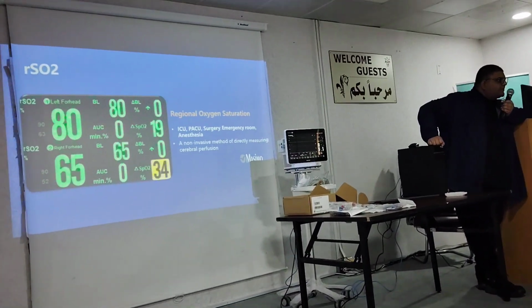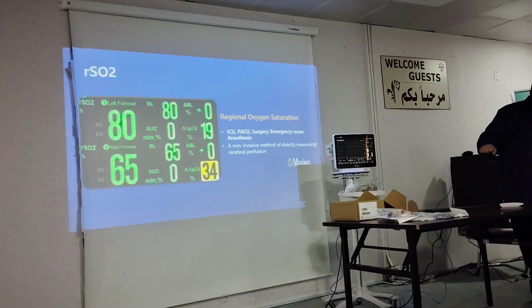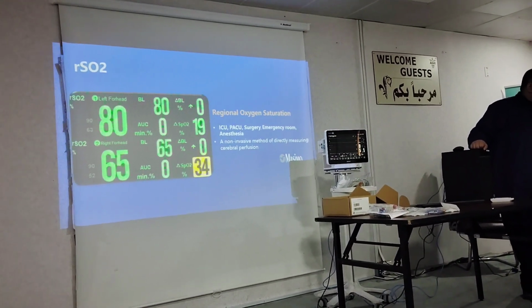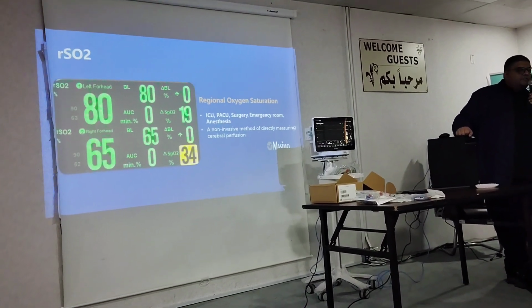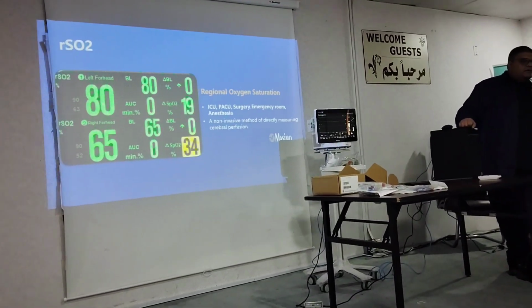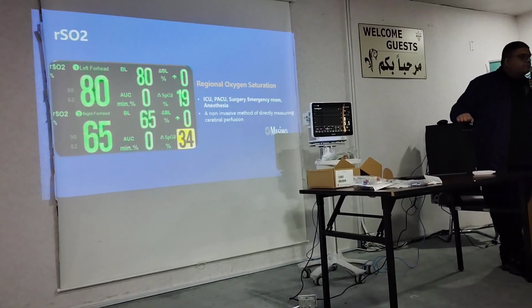Why is there so much oxygen in the tissue? It shouldn't be. That means your tissue is not using the oxygen. If your tissue is not using the oxygen, that means the tissue is dead. Okay? Another reason why the regional oxygen saturation might be 100 is because of bleeding.